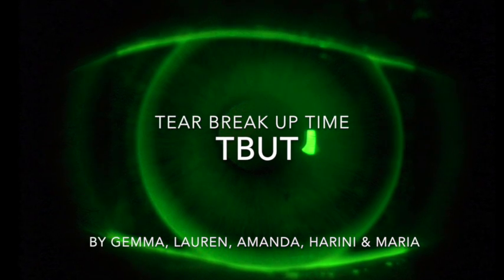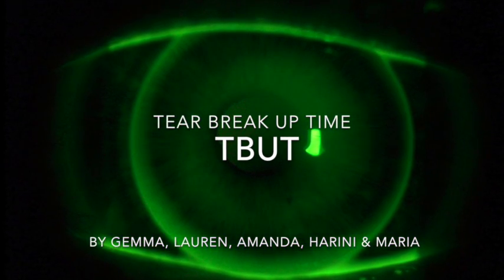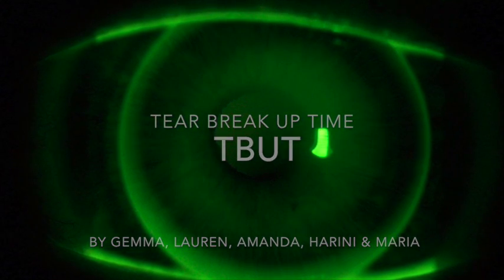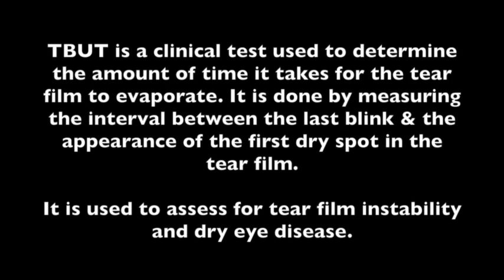The purpose of this video is to further educate orthoptic students about performing the clinical test tear breakup time. TBUT is a clinical test used to determine the amount of time it takes for the tear film to evaporate. It is done by measuring the interval between the last blink and the appearance of the first dry spot in the tear film. It is used to assess any dry eye disease.